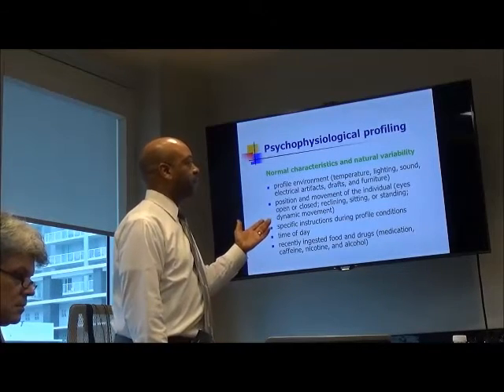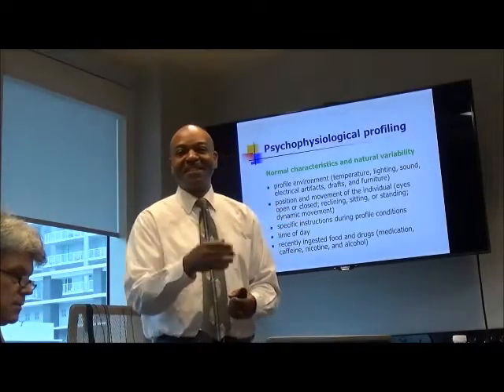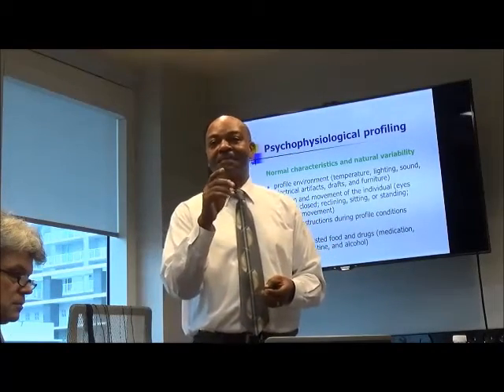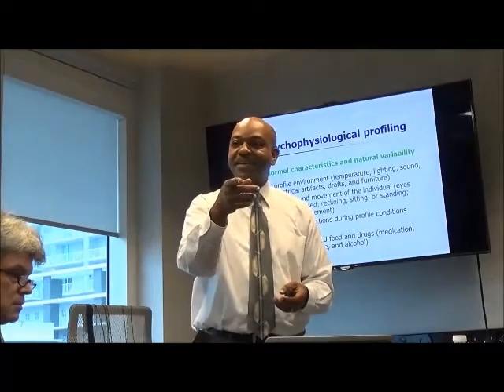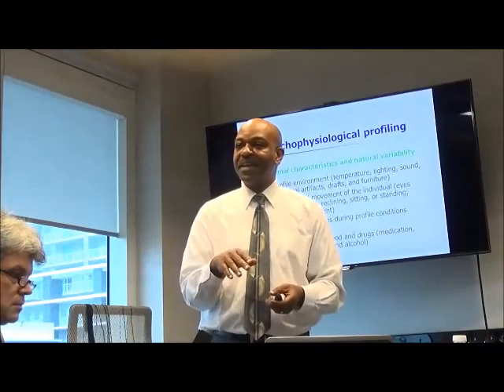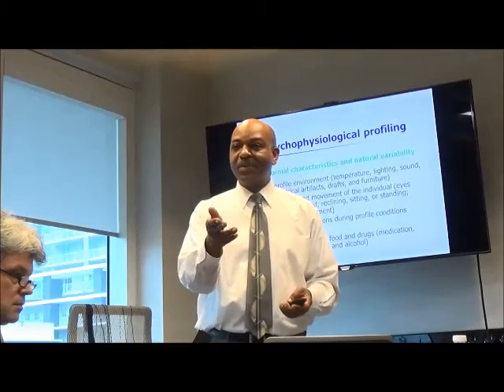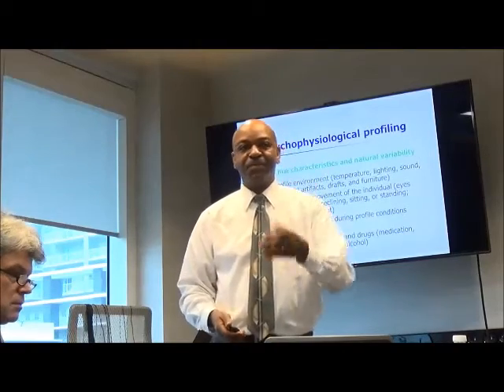The environment, so the temperature of the room. I was mentioning here, while this morning I was feeling cold, again, just like yesterday it was cold, so I checked. I wanted to make sure it wasn't just me, so I turned on the instrument, and I saw that the room temperature was 70 degrees. So I went and I asked if she could turn the air conditioning down, and she did. And I continued recording, and the temperature went up to 74 degrees within a few minutes.